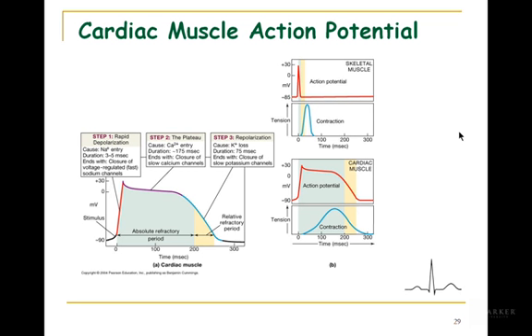Okay. So this is going to be the last part of this lecture. During class, we'll discuss some abnormal ECGs. So if you know the normals and what each thing represents, when we discuss abnormals, it will not be very difficult at all.